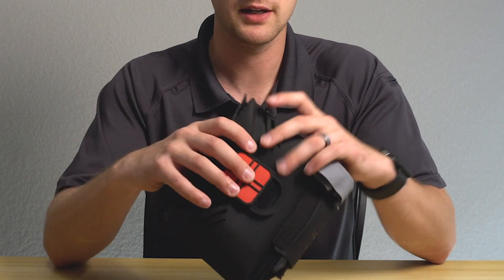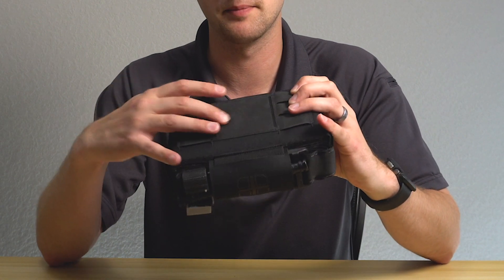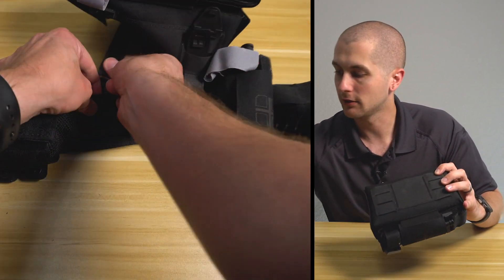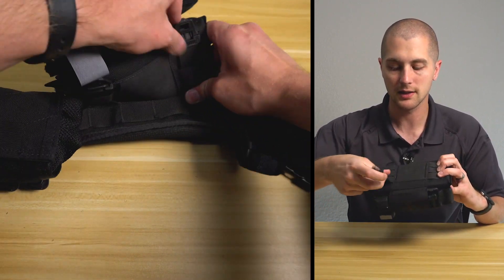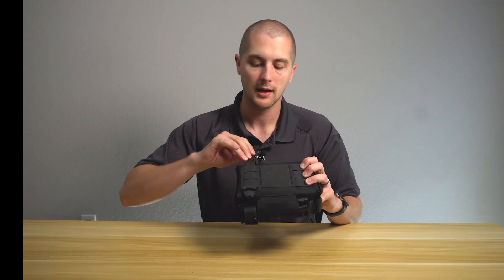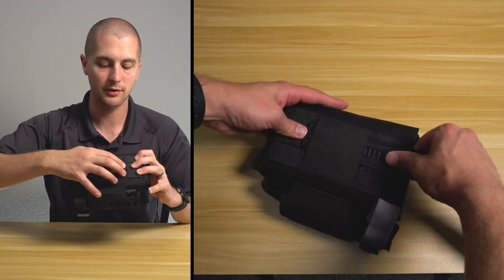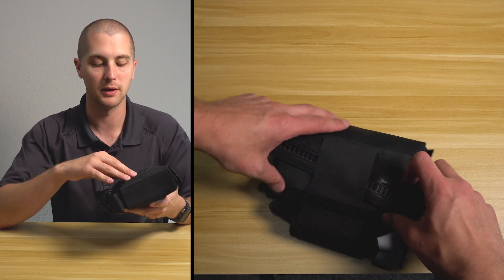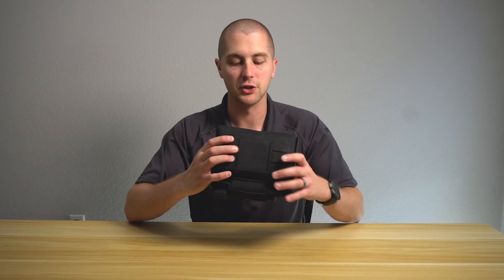The outside of the kit is a Cordura laminate and then you have Hypalon backing. On the back you can put some Malice clips through here if you want to mount it to a vest or something with MOLLE attachments. This also has a belt loop that you can thread through pretty much any size belt — a duty belt or a thinner battle belt — and it will fit just fine.